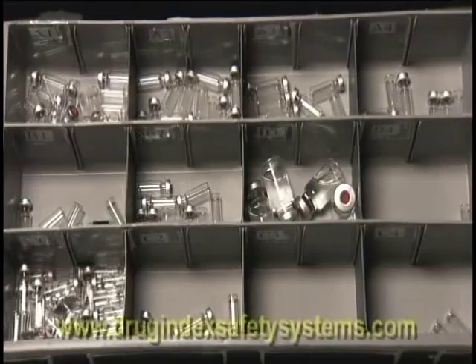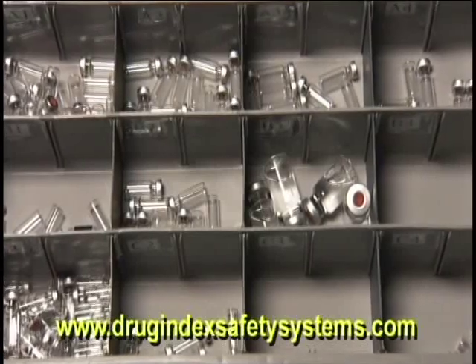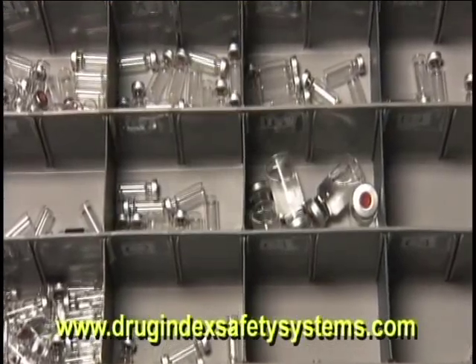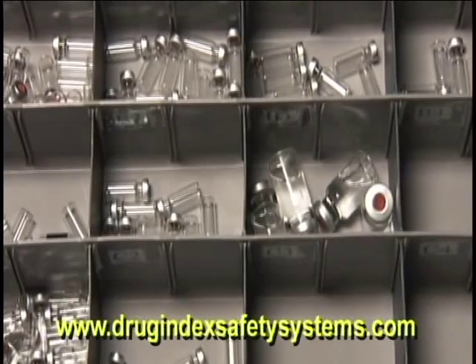For 2 years now, I have been working on a solution for drug dispensing errors. These errors occur moments before drugs are administered, when a drug is being selected from a storage cabinet. The first step in a medication error often occurs days or weeks before, when a drawer is stocked incorrectly, or when an unused or multidose vial is returned to the cabinet.